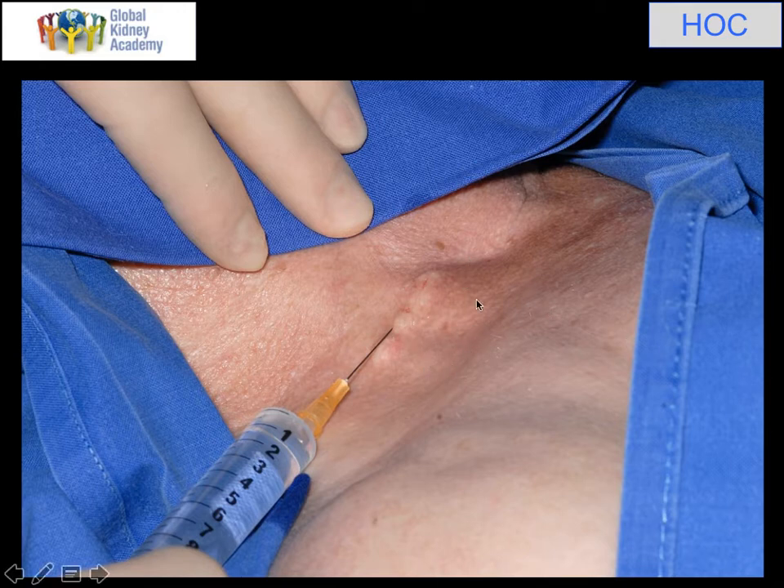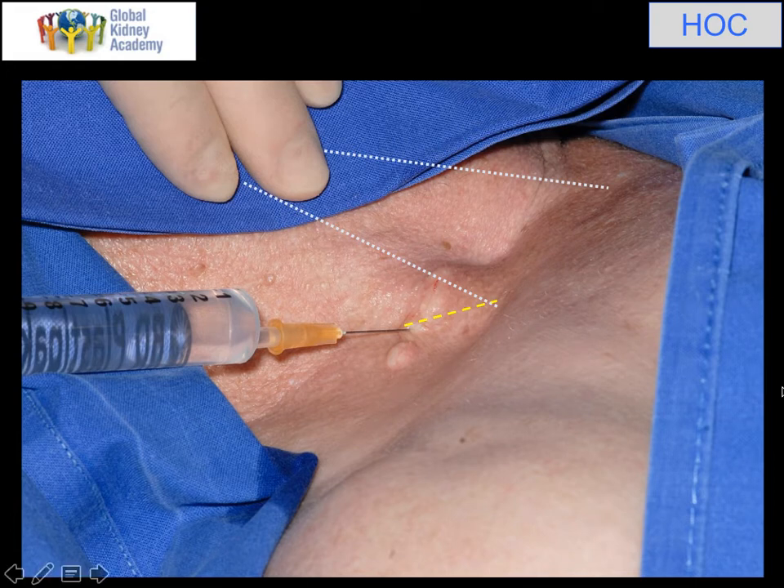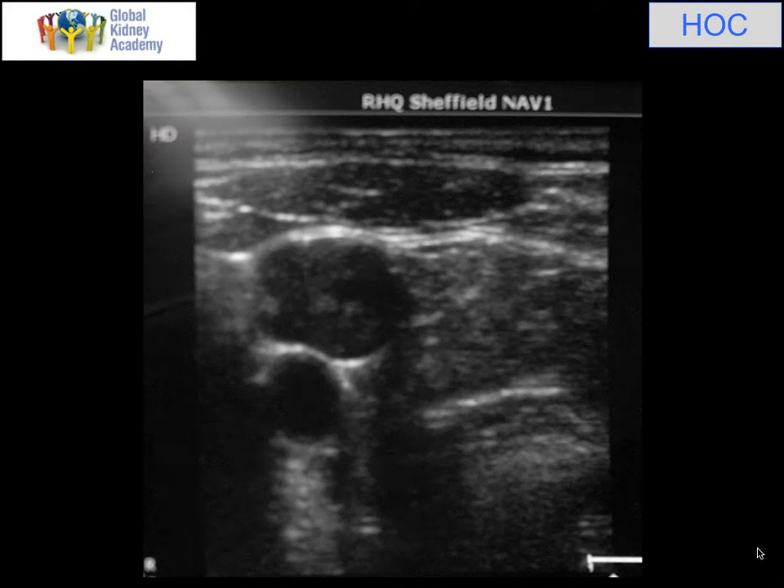I've scanned the patient's neck with ultrasound, worked out where I want to go, and then I've begun to anaesthetise the skin as a strip of local anaesthetic — you'll see why in a moment. It's worth showing the anatomy. These are the two heads of sternocleidomastoid: the sternal head and the clavicular head. For reasons I'll explain later, I'm actually going to puncture this vein from lateral and low down, lateral to the clavicular head of sternocleidomastoid. Usually you would start up here in the triangle for a temporary catheter, but it's slightly different for a tunneled catheter. This is how it appears on ultrasound with the carotid artery at the bottom, the right internal jugular, and the muscle and fat layers above.